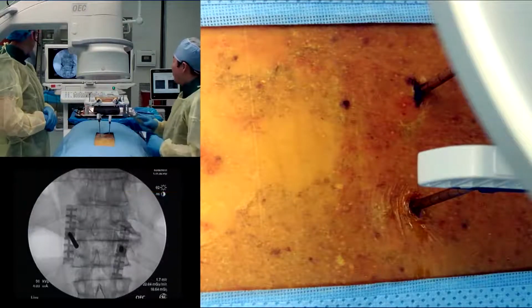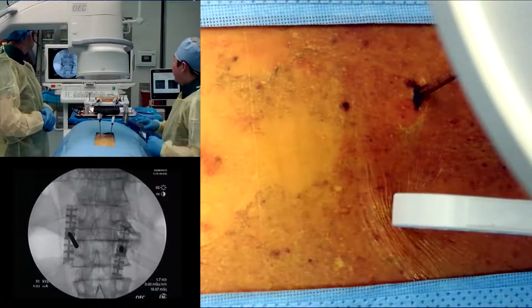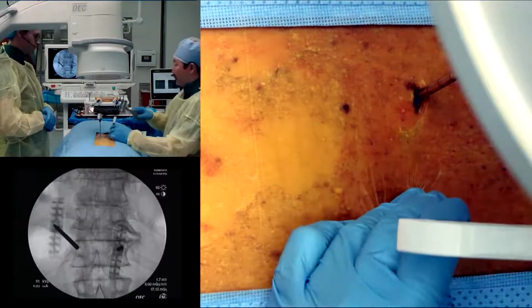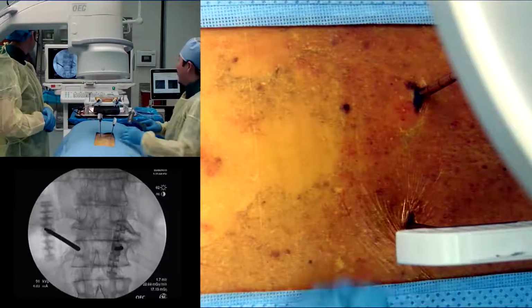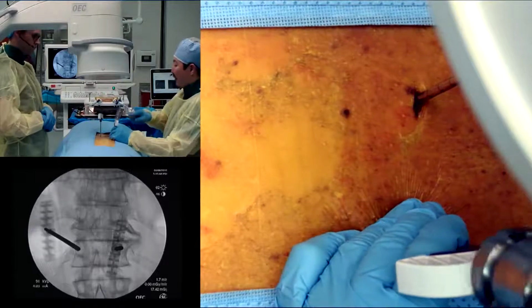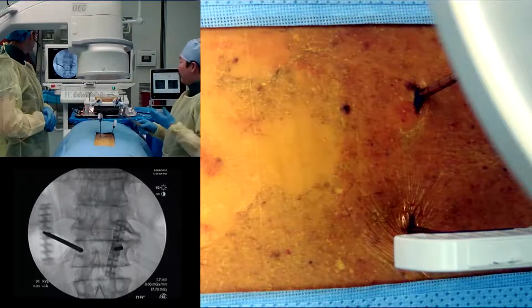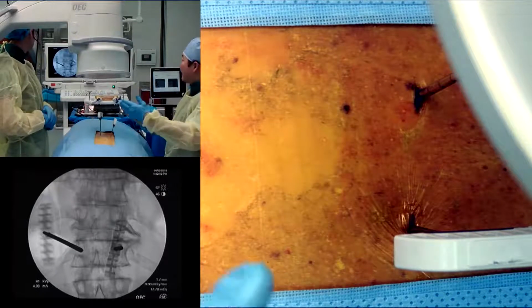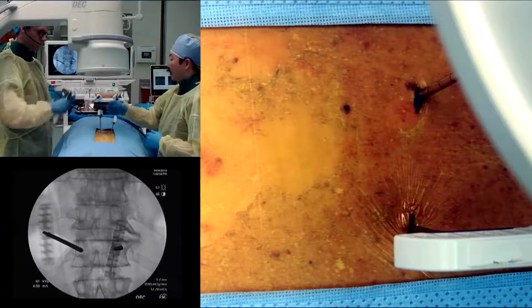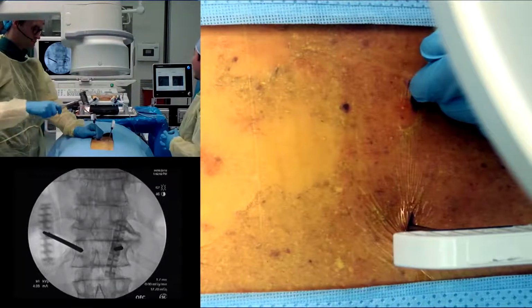Picture that. There you go. That's kind of the angle that I want. I'm in the pedicle now, and I'm headed toward that mid portion of the picture. And now I just hit the medial border of the pedicle. So as long as on the lateral view I'm anterior to the posterior vertebral line, it's going to be looking pretty good. And I would mirror what I did right there, Zane.